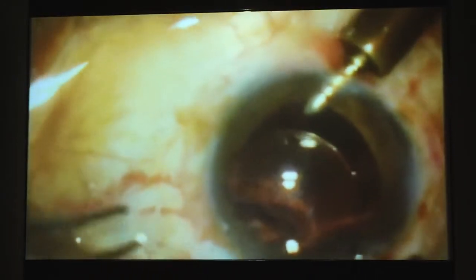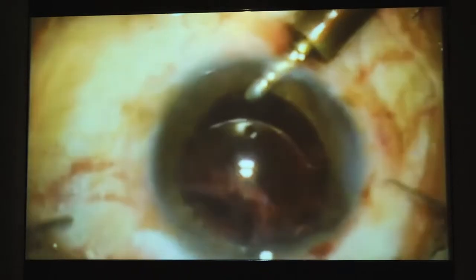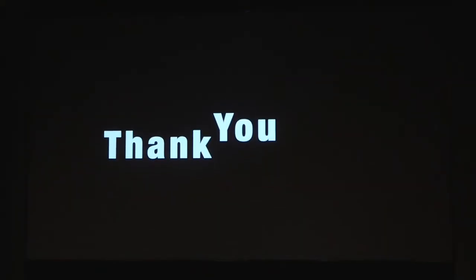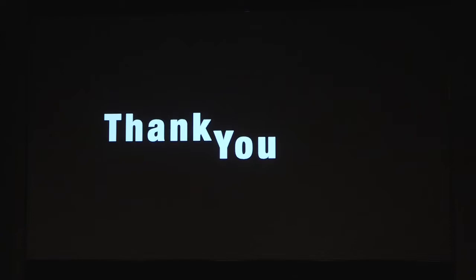So whenever you are dealing with any such type of hard cataract, or you can say nuclear cataract, it is always better to go with this. And now this is the AC maintainer and I am doing it by this.